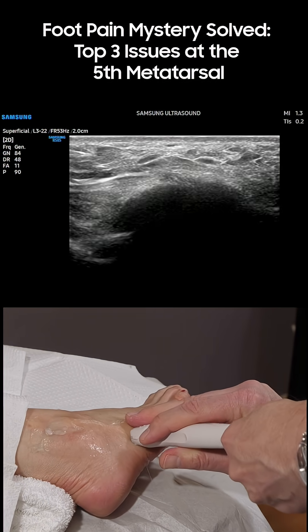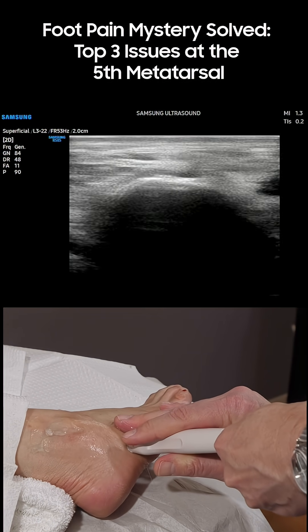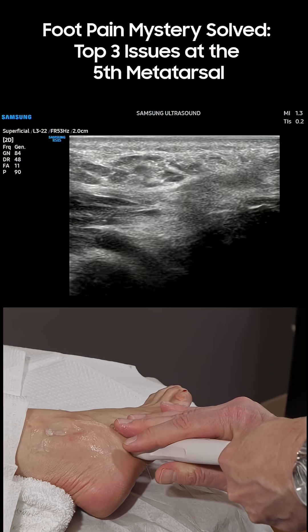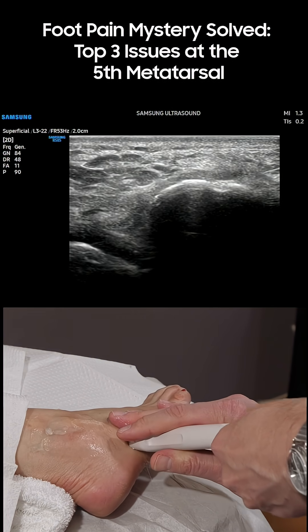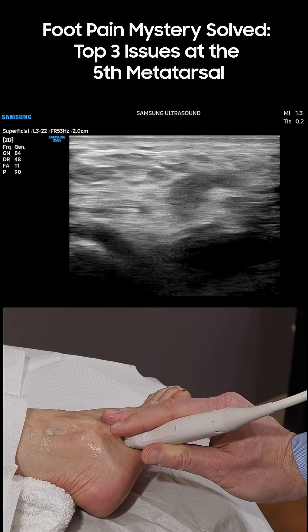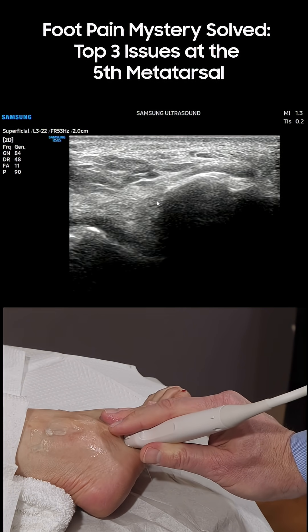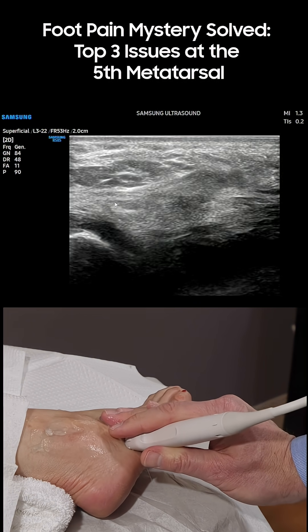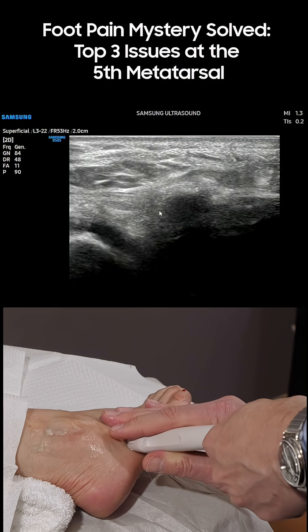Like this. What we'll see more proximally now is the attachment of the plantar aponeurosis right here. This can be a very common site of pathology as well.